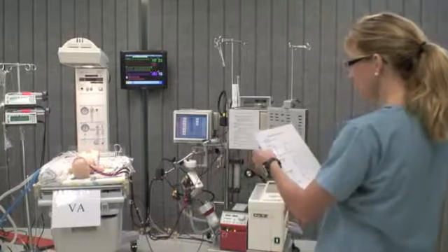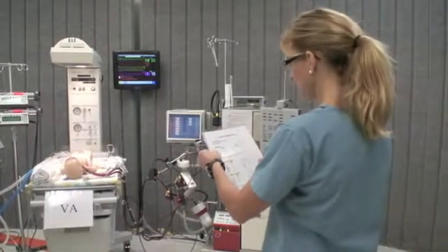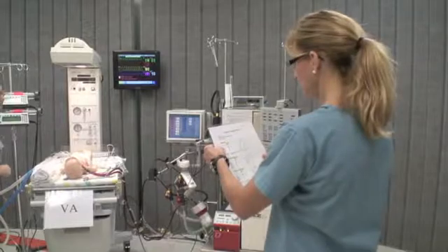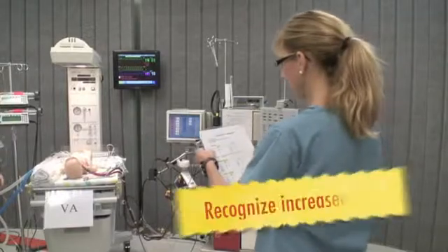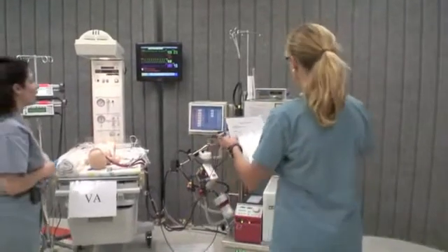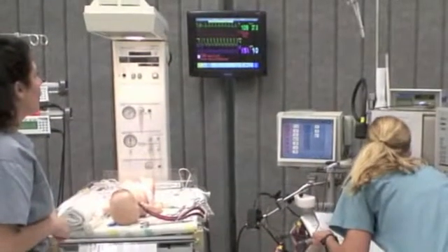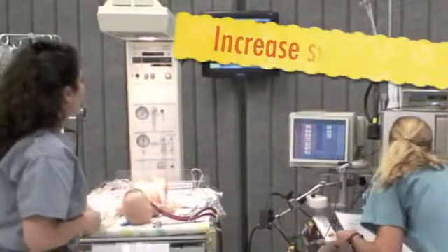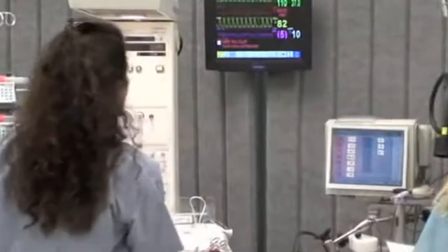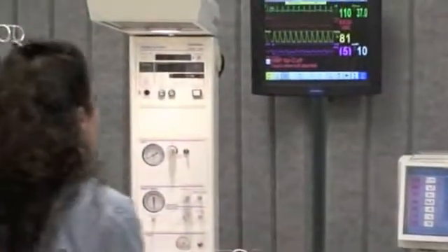It looks like my stats are dropping, and I'm looking at my patient gas. My CO2 is up and my PO2 is down, so I'm going to adjust my sweep and my FiO2. I'm going to go up to about 50 and go up on my sweep. Should I do anything else? Our stats are getting pretty low here.